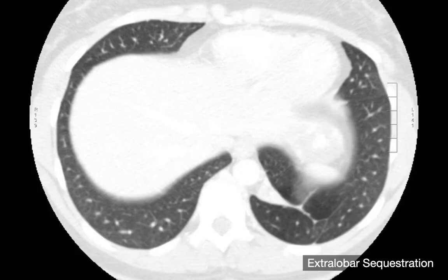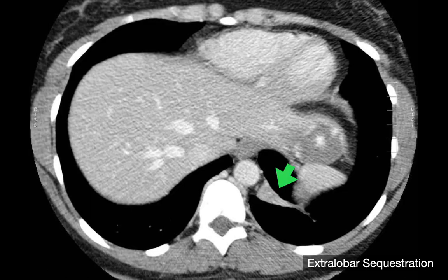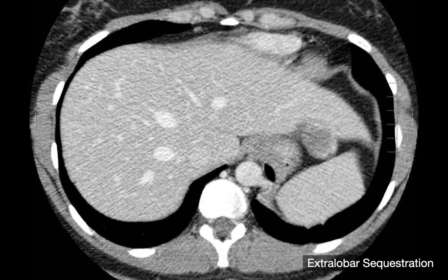This next image shows what an extralobar sequestration may look like — that fat triangle at the medial left lung base. Extralobar sequestrations behave a lot like atelectasis because they don't communicate with the tracheobronchial tree, so they don't get the chance of having air introduced to them. They're not going to be a large air-containing consolidation generally because they're relatively sterile. On the next image slice, you can just barely make out the enhanced blood vessel coming off the aorta feeding this triangular mass — another specific mass, in this case an extralobar sequestration.